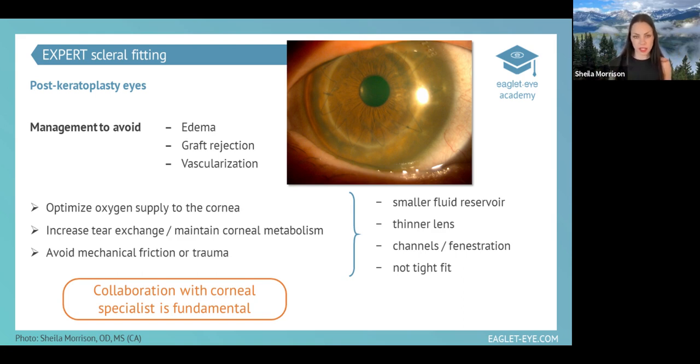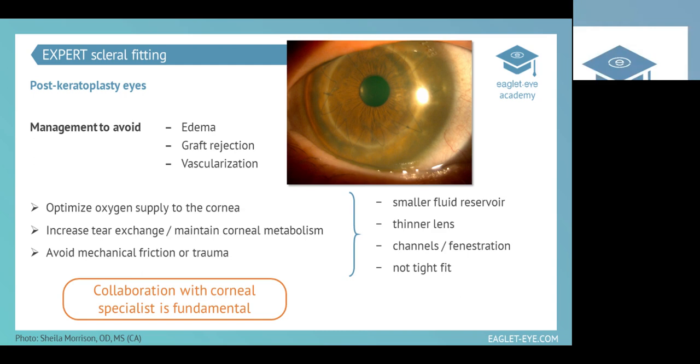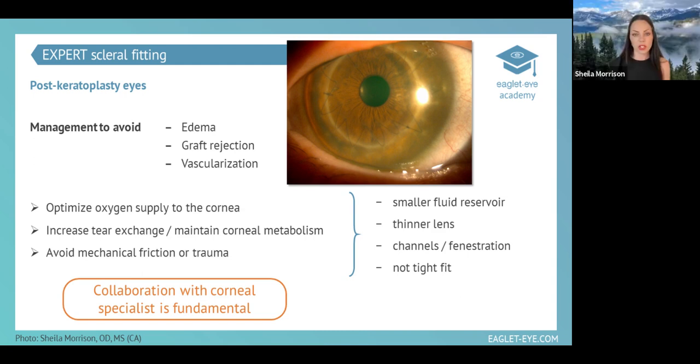One of the things we use a lot, and I know most of us collaborate with ophthalmology as well, is that whenever it comes to high-risk eyes, we always like to collaborate. Often our patients will split their time and see a cornea specialist to do a double check for us, make sure that they're happy with the health of the cornea, maybe in ways that we don't necessarily have in our clinics, like endothelial cell count, and just to ensure that there's nothing happening related to the lens wear.